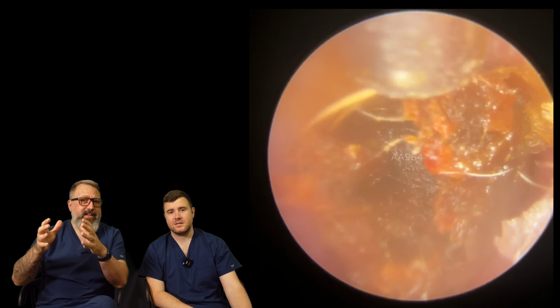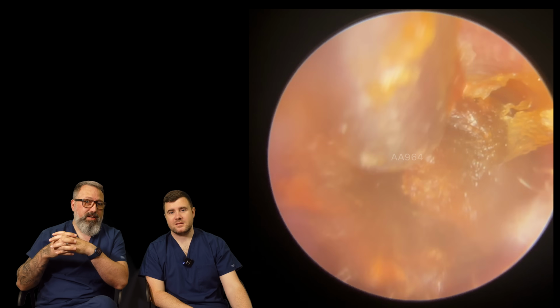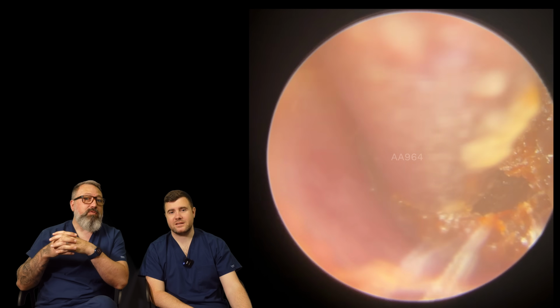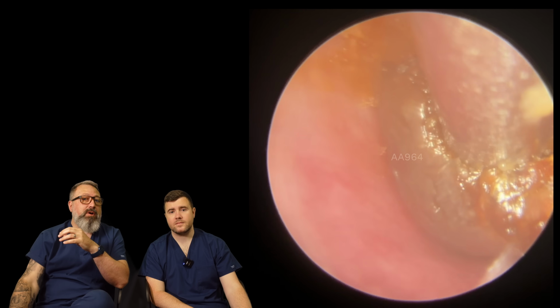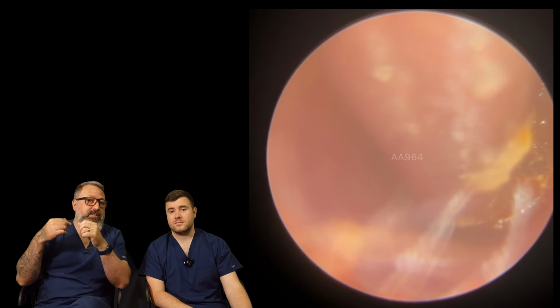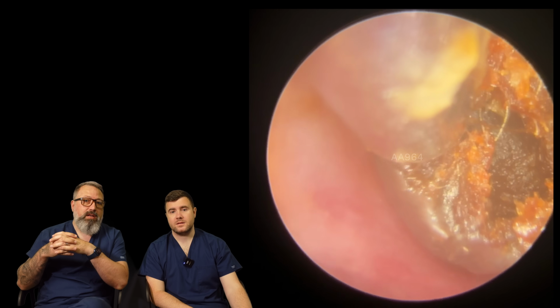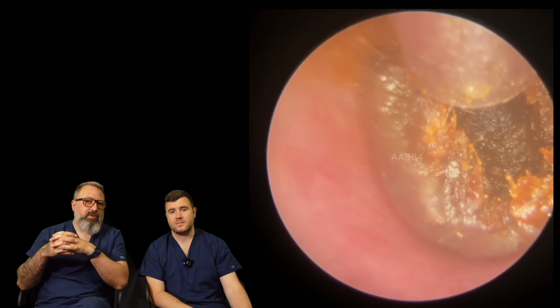So trying to fold the sides in here a minute. It's just starting to come together a little bit. Gosh, he must have been struggling. He was really struggling, bless him. This gentleman actually did some clay pigeon shooting as well, so he puts ear defenders in quite regularly, which is why we get these kind of issues here. It's just compacted the wax a little bit.